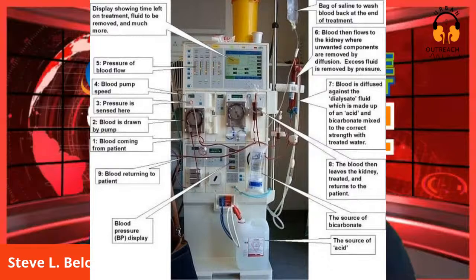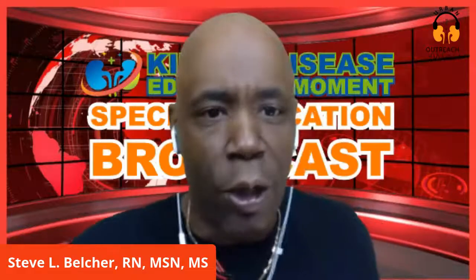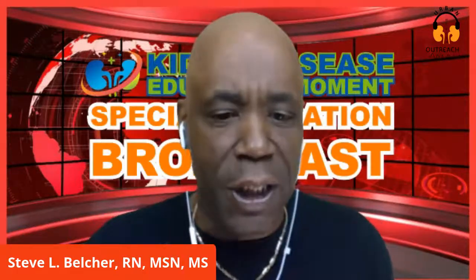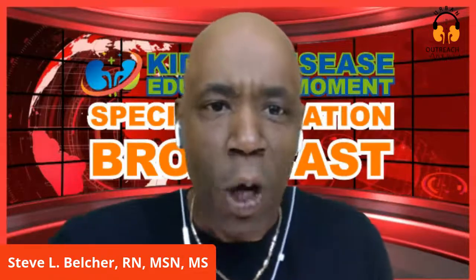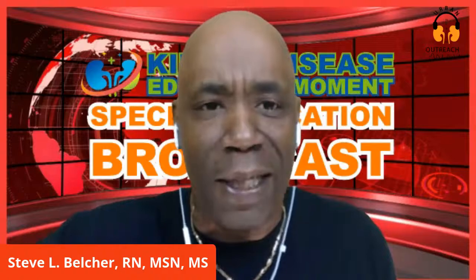Everything I just described: it circulates your blood through the dialyzer, it keeps track of blood flow and blood pressure, it measures how much fluid is removed from your body, and it mixes dialysate used to clean the blood. How many clinics will tell you or told you how this machine works so you can understand your treatment? That's what we do here at Urban Kidney Alliance.